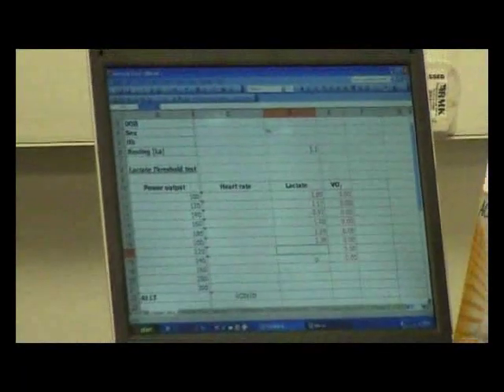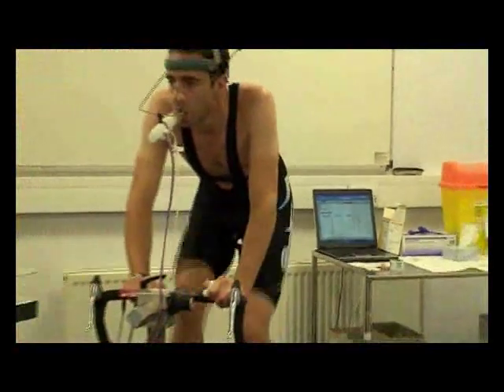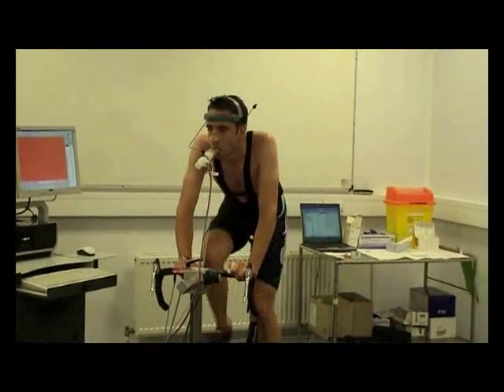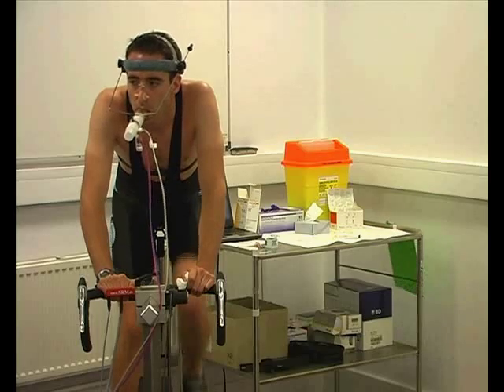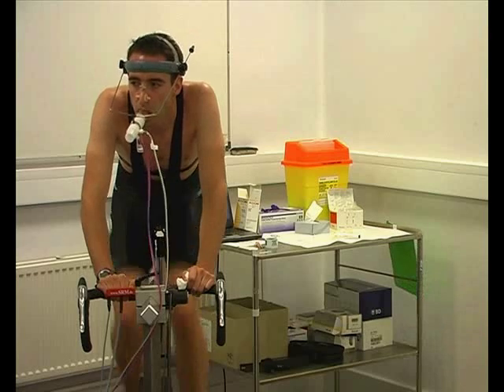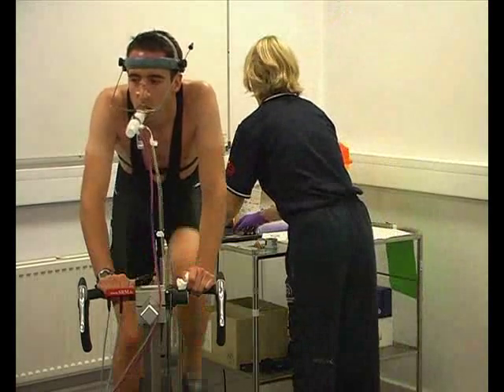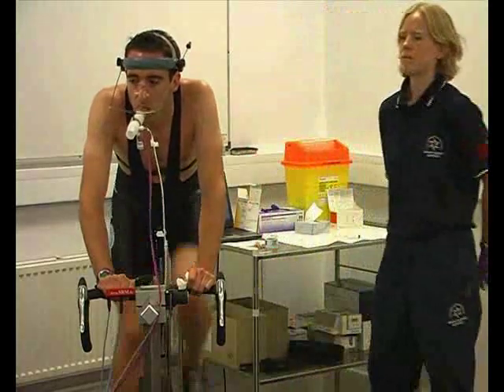Seven stages in, we're starting to get some nice data now. You can also see from the oxygen uptake data he's starting to work quite hard. At 220 watts, he's using about 3 litres of oxygen, exactly what we'd expect. We've now got the blood lactate sample value at 220 watts, so we can enter that in.